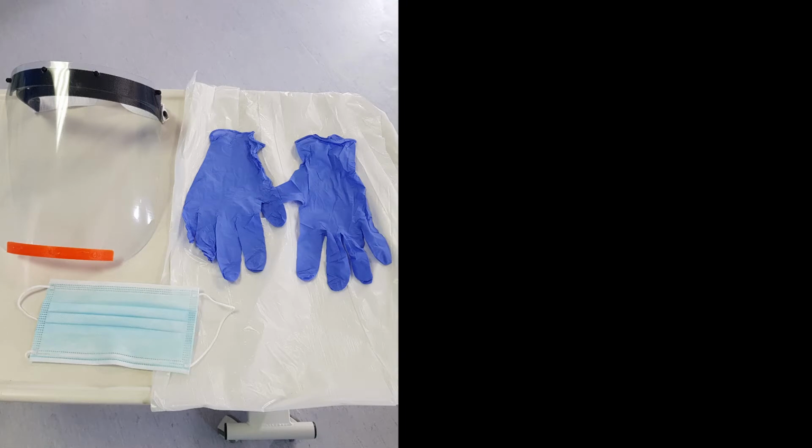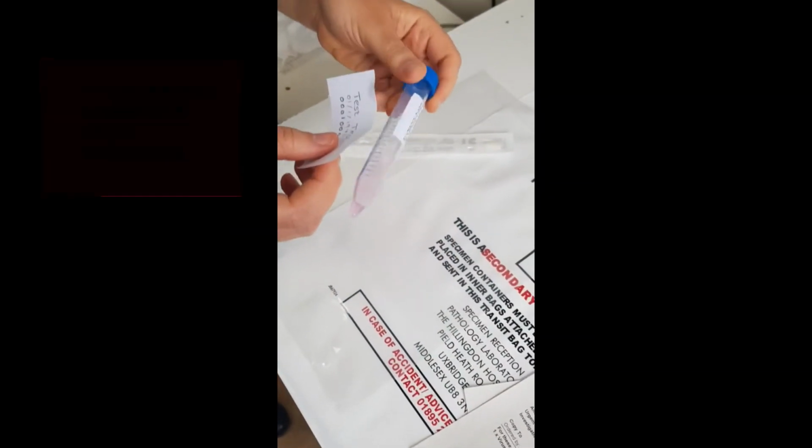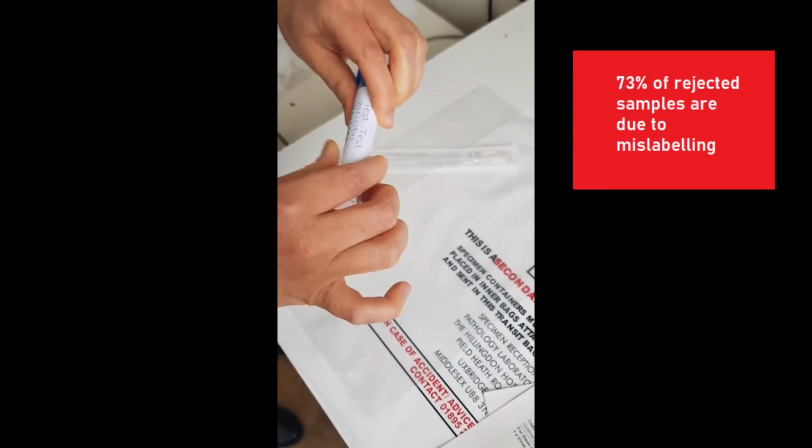Only for those patients with aerosolization of the virus further protection is needed. If in doubt, ask for senior advice. Label the container with a patient addressograph. This is a critical step and many samples have been rejected due to poor labelling.